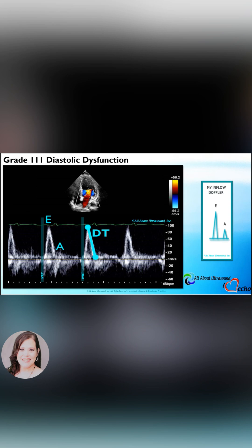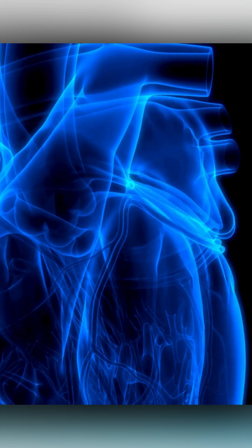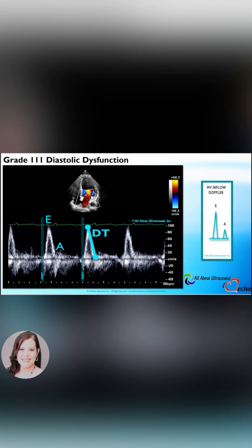Patients in atrial fibrillation will often have a loss of the A wave due to ineffective left atrial contractions. Be careful not to confuse the two.